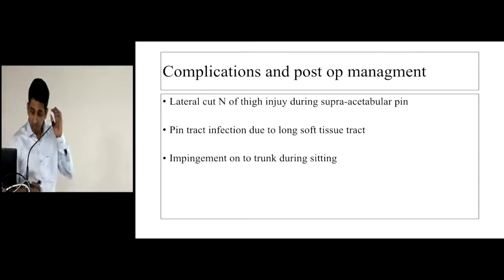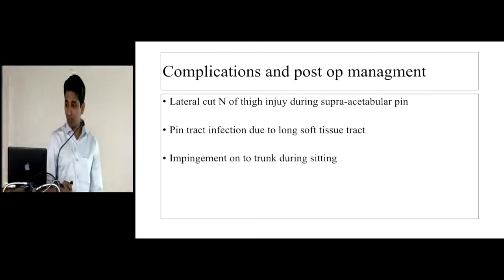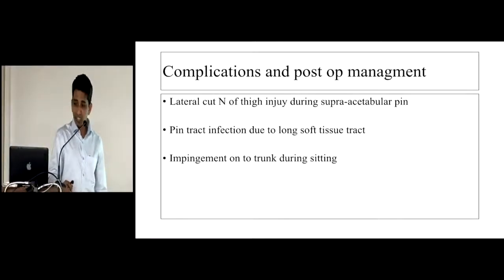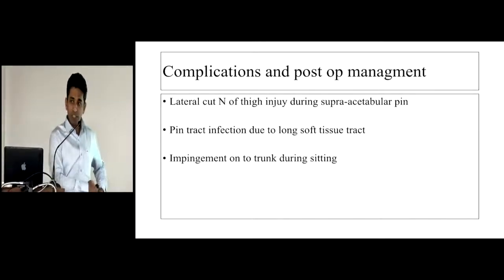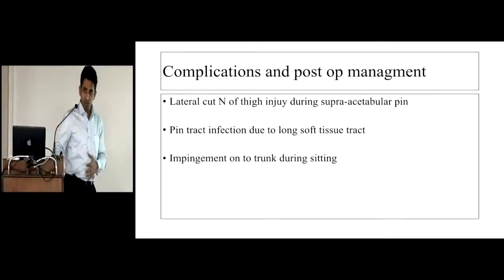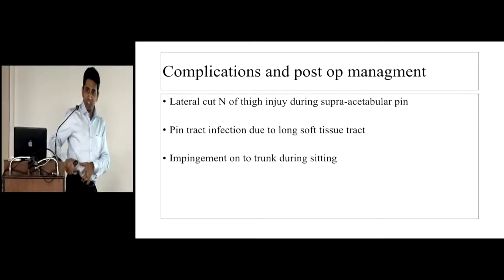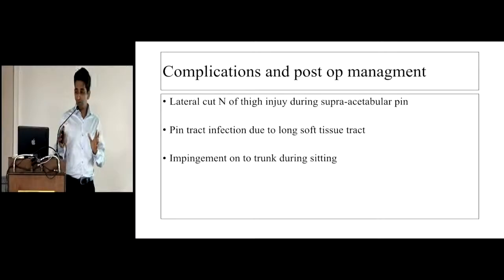Complication-wise, lateral cutaneous nerve of the thigh injury is more common in the supraacetabular kind of fixator. Pin tract infection, again, is more in supraacetabular because of the larger soft tissue tract. With the crest, it is a smaller soft tissue tract. And there is impingement on the trunk while sitting. So when you try to sit, the supraacetabular fixator tends to impinge onto the lateral aspect of the abdomen. Those are the problems with the supraacetabular fixator. However, the stability is more with supraacetabular.